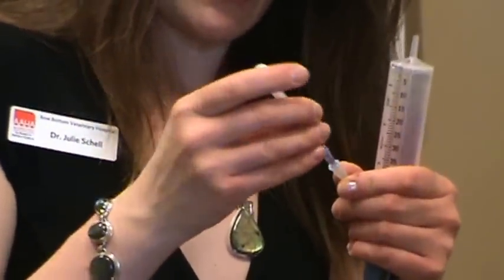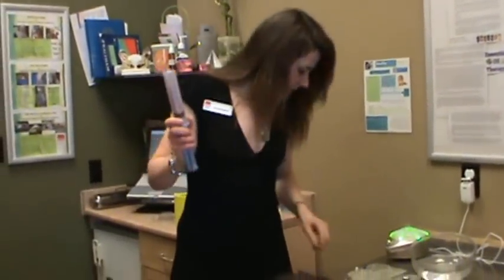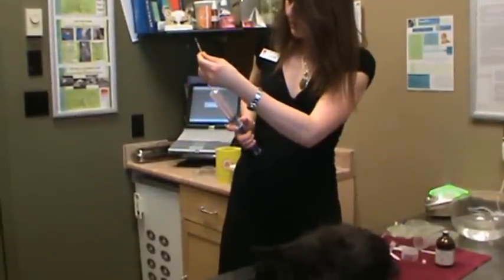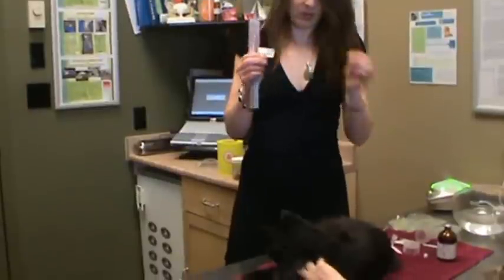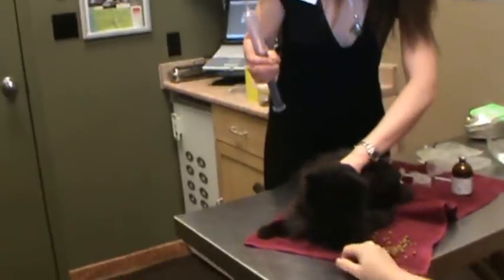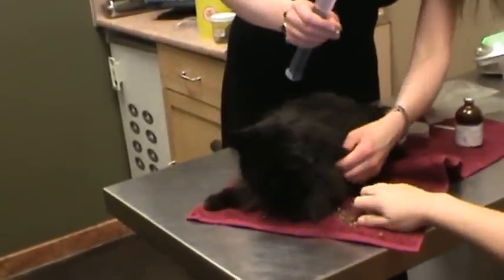You'll see that it turns a nice reddish pink color. Then I like to remove the air bubbles. I get my butterfly catheter — as long as it's been kept sterile — and push out any remaining air bubbles, which clearly there aren't many. This time I'm going to go on his other side. Because Shaka is so dehydrated, the fluids go in very quick and very easy, and he's absorbed quite nicely already. So now I just do the other side and make a skin tent.